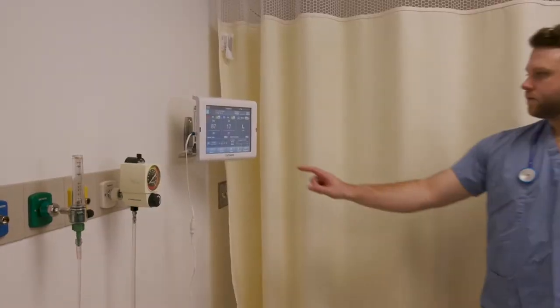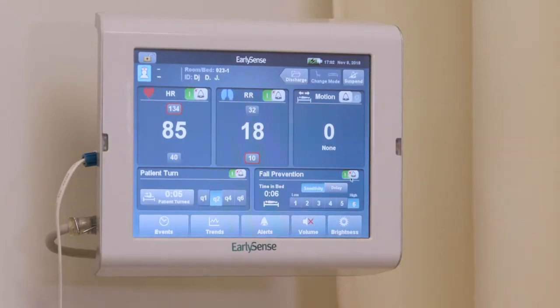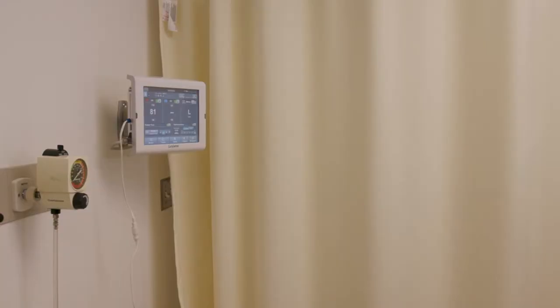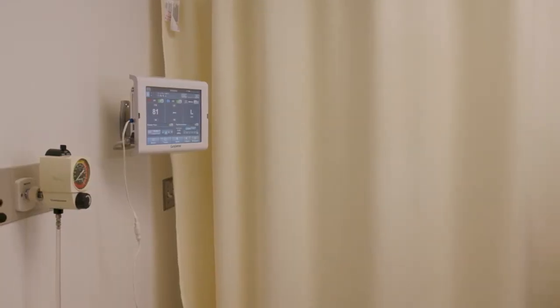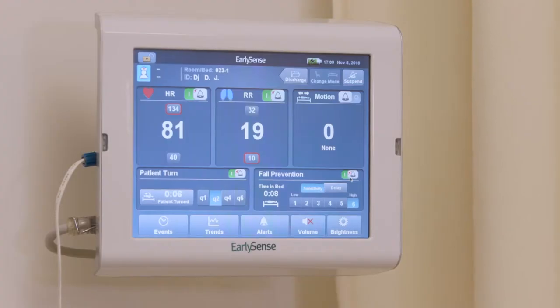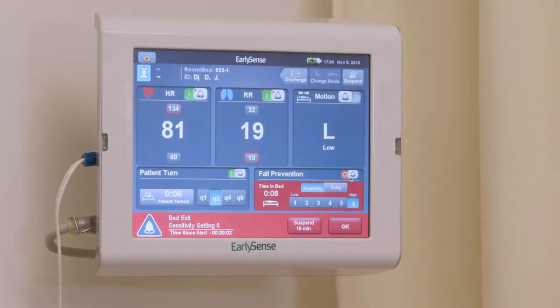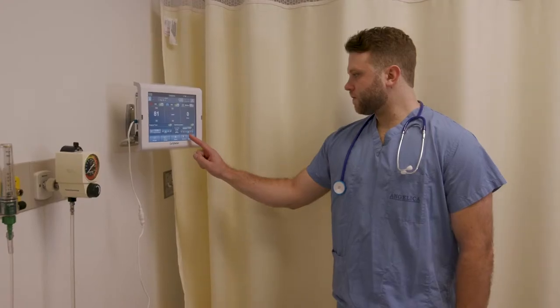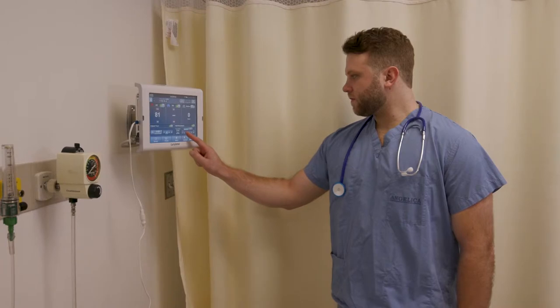You can set the system to alert you if a patient is attempting to leave their bed or chair, or if a patient has exited their bed or chair and did not return after a certain period of time has gone by. There are six sensitivities for bed exit alerts.